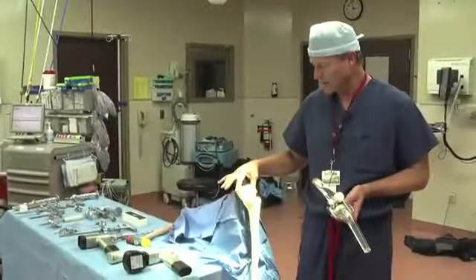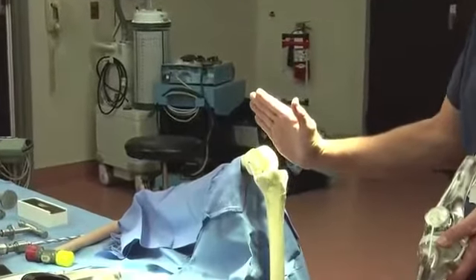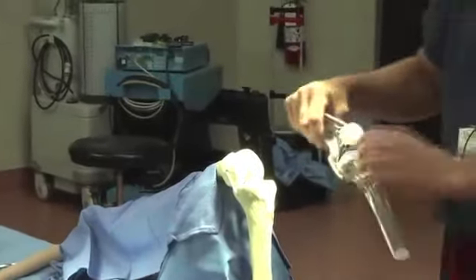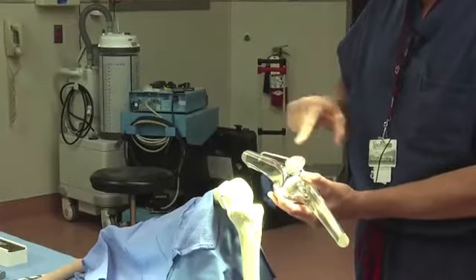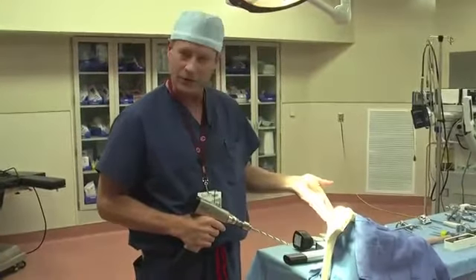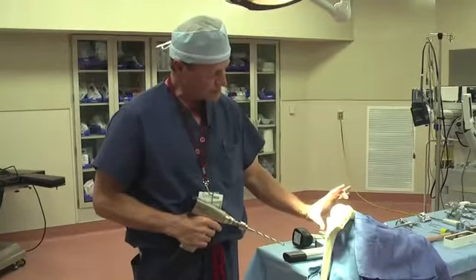This is just a model of the femur, or the thigh bone, and the tibia bone down below. When we first make our incision, we make a skin incision directly in the front of the knee, and then we go inside and actually rotate out the kneecap. On this model, we'll rotate the kneecap out, and then we take off the spurs, or what we call the osteophytes, and make a cut to make it flat on the patella and put a plastic button on. Once we've prepared the patella, we evert it out and have a retractor that holds it out of the way and a retractor from the inner side that holds the soft tissue, giving us good access to the knee through a limited incision.